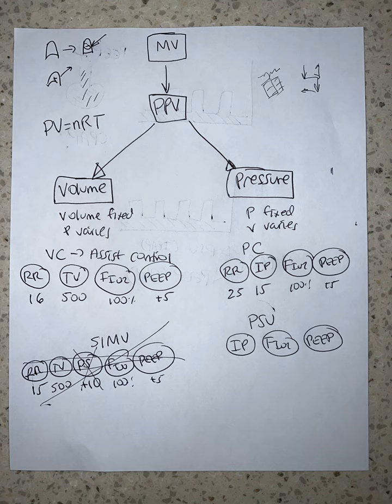You can do it on an invasive ventilator, or you can do it on a non-invasive ventilator. But they're the exact same. I can ventilate somebody just like I have them intubated on BiPAP, non-invasive with a mask, and I can do the same thing with a tube. Both are the same. And now, non-invasive has really burgeoned in use because you can do the same thing.